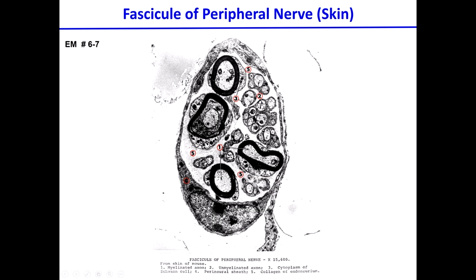Yes? I'm sorry? These are axons. This one? This is the myelin. This is the inside of the axon, and these portions are different sections in which you have cut the Schwann cells around it that are actually the bodies of the Schwann cells. Any more questions? Yes.